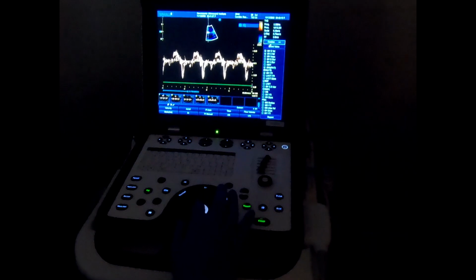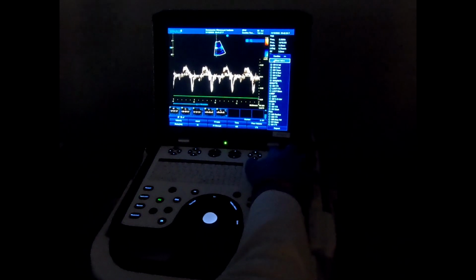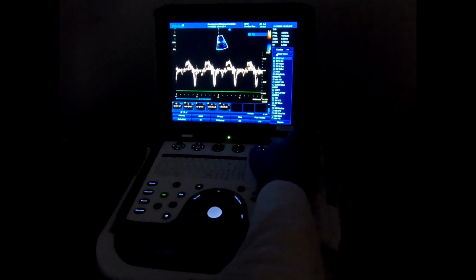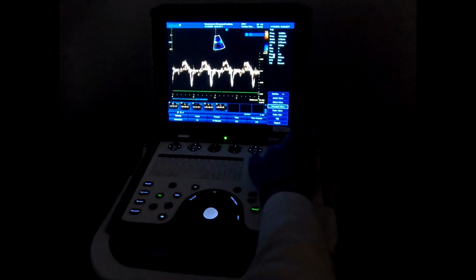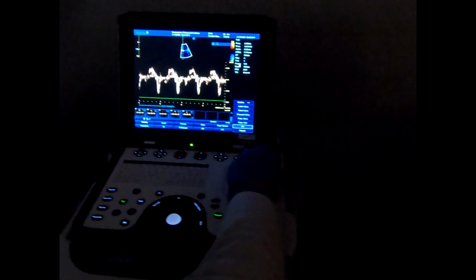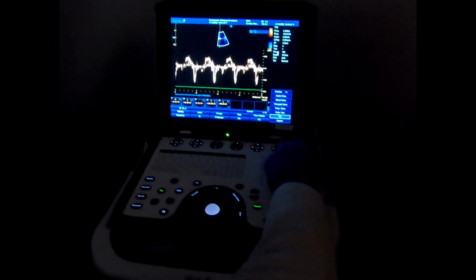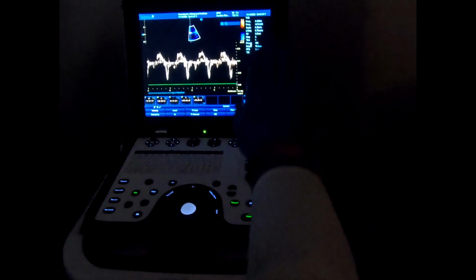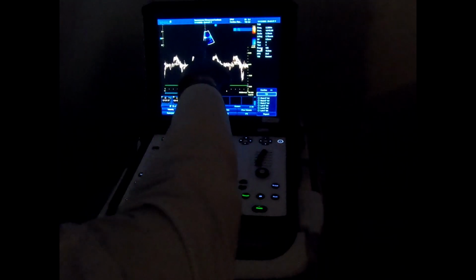Okay, so going for TDI, I think we have a package for this, I'm sure. We put here, see TDI? And now we have a medial and lateral, 3 medial and 3 lateral. So this was a medial one, yes?